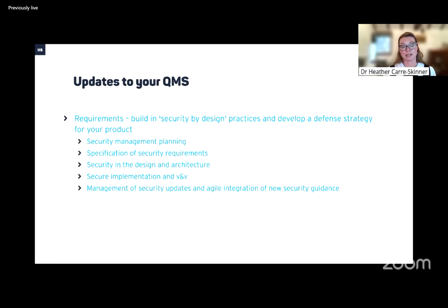It can be done in an iterative way. Thinking about security in the architecture, so having a good idea of data flow, data movement, looking at the vulnerabilities there and getting some security in place. Actually implementing it, doing it, and then also testing it. And then how you are going to manage any updates and integrate any new security guidance as well.